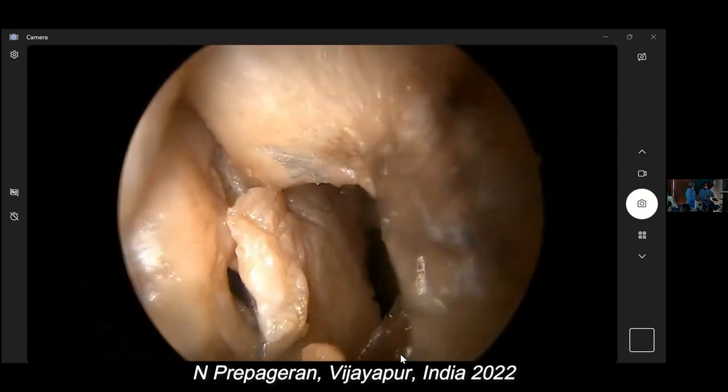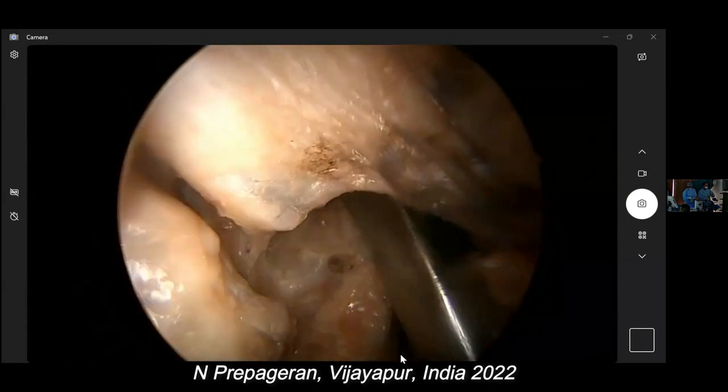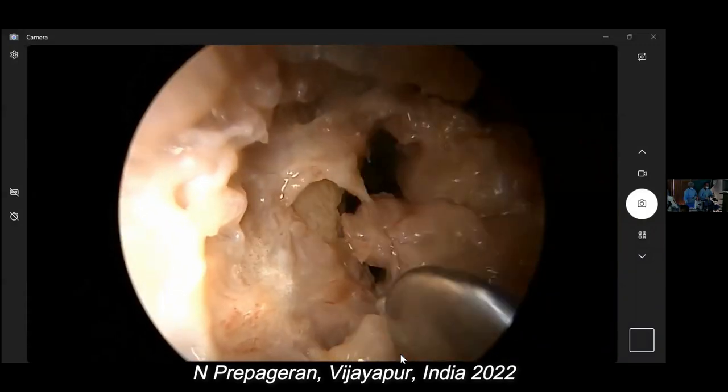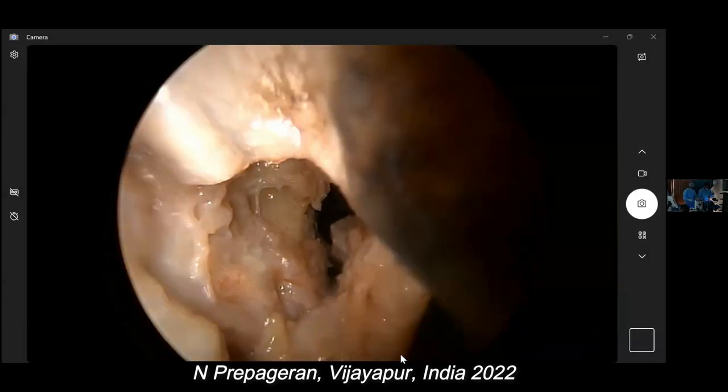Once you have done that, I'm going to remove all this mucosa. Okay. Mucosa. And if I go into this space here with the chisel, this becomes a prelacrimal approach.